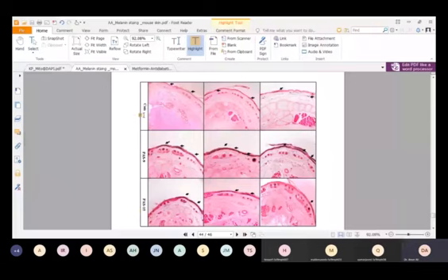Here in control, you can see the arrowhead. These arrowheads indicate the brown or black color present in the outermost layer. Here, this is the melanin. You can see it here as well. This is very little compared to the treated sample, PAS 9. Here, for example, you can see the darker layer of melanin. So after PAS, there is more melanin content compared to the control. It means plasma is increasing the melanin content.